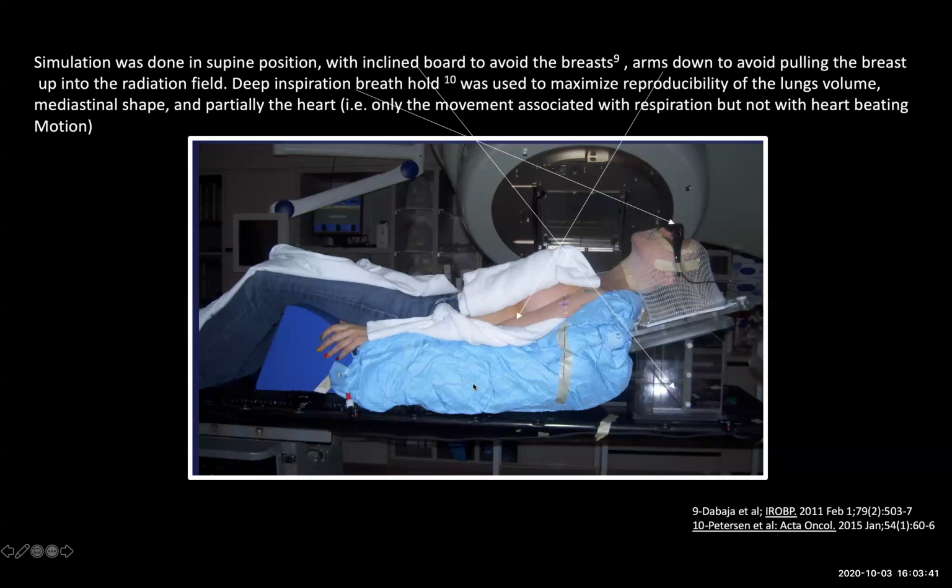We also have a VAC lock that we consider more of a lymphoma VAC lock, and it ensures that the patient is in a stable position, the neck in a stable reproducible position, the shoulders, the elbows, all the way down to the bottom part of the patient. And because the patient is on an inclined board, it is helpful if we put a thigh stopper to prevent them from sliding down.